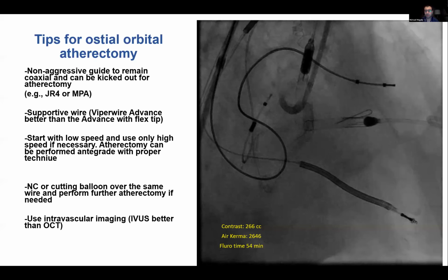Actually, IVL works pretty well. As you know, we were using the peripheral ones before, and the peripheral ones are bulky, difficult to deliver, 40 millimeters and all that. And the coronary ones, we have used a fairly good amount, and it really works pretty well. It is more deliverable, but even with the 12 millimeters, it's still bulky. And it's very reasonable to use in very tortuous vessels where we worried that atherectomy would cause perforation. I don't see that this would be the case in this scenario, in my case, at least right now.